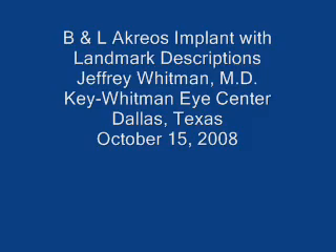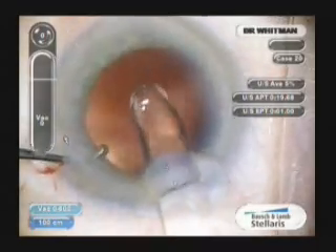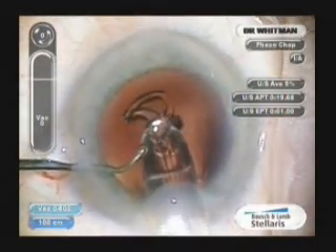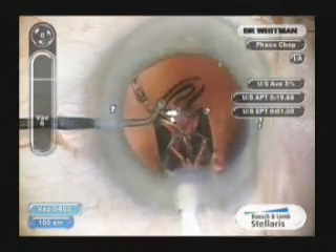This video shows a classic insertion of the Acryos acrylic IOL by Bausch & Lomb. The injector is inserted in a planar fashion into the anterior chamber through a 2.8mm incision, and it's simply allowed to unfold.